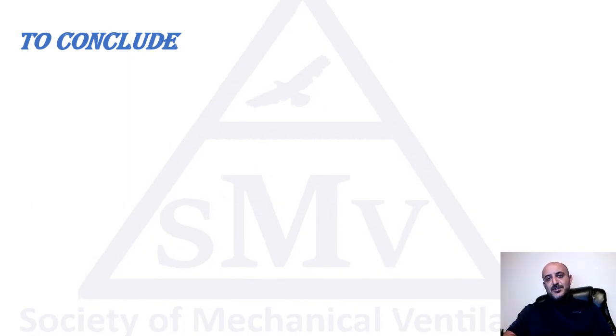So to summarize that long video, I want to summarize a couple of the important points that we talked about. One is our lung is very heterogeneous and it's a very complex problem. Sometimes we try to oversimplify a very complex problem, for example, by the PEEP FiO2 table, and I know a lot of people would not like that, but that's my personal opinion. Again, our lung is heterogeneous depending on the stage of the disease, the severity of the disease, the nature of the disease. So PEEP should be custom fit for the patient.